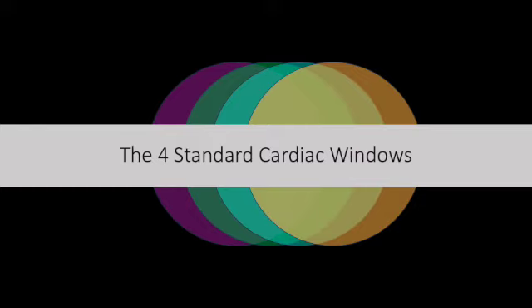The remainder of this lesson is going to focus on the key images I want you all to recognize as optimal views of the heart that you should aim for when achieving a bedside echo. These 4 windows give us a great estimation of cardiac function and answer most of the clinical questions that commonly arise when caring for patients with suspected cardiac pathology.